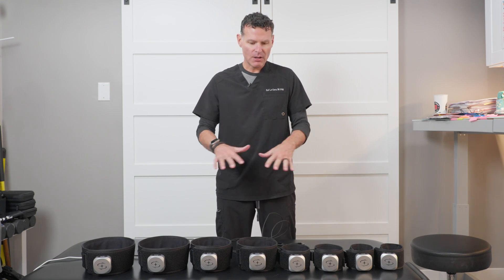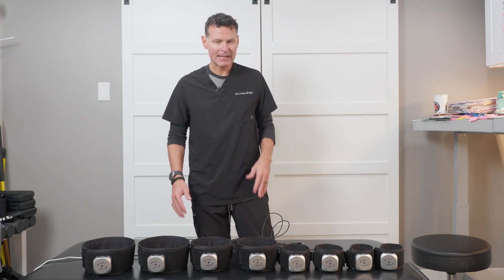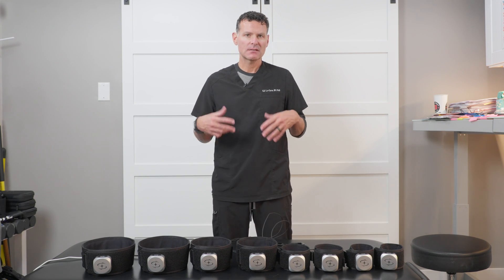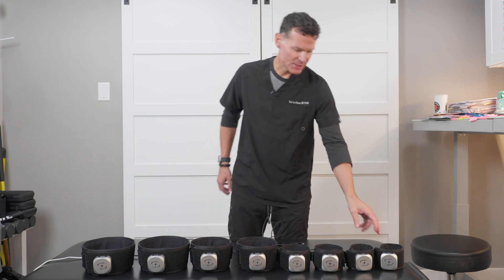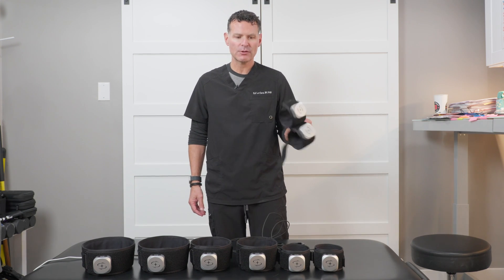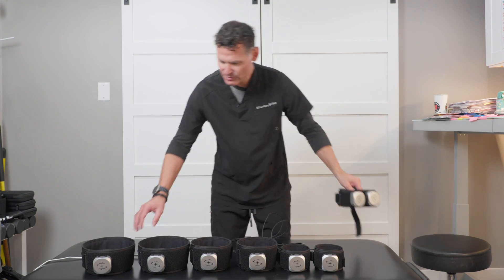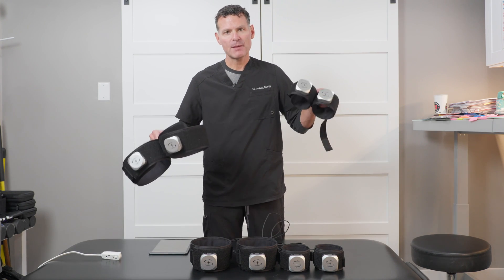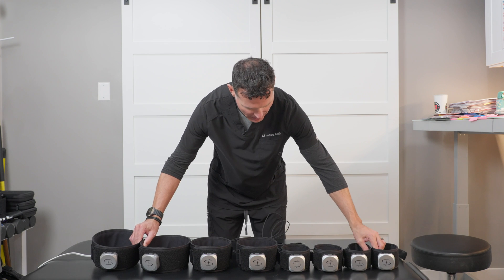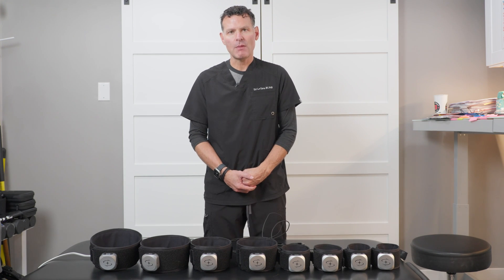I have them all laid out in front of you. This is what you'll get in the kit depending on how many you purchase. Some people will purchase just two cuffs if they're only going to use them for their upper extremity or lower extremity. Some people will choose to get two sets — two for the upper and two for the lower — or you can get all eight cuffs in the clinical model.